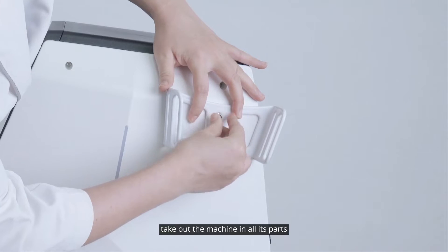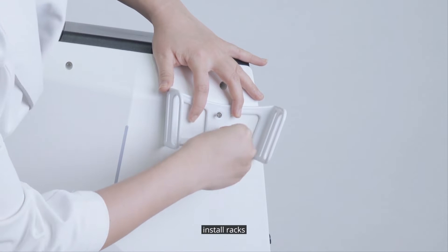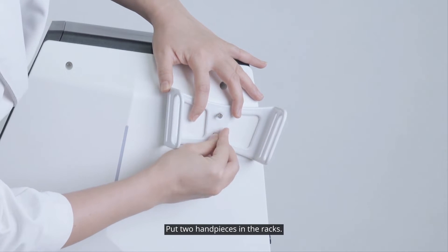Take out the machine and all its parts. Install racks and put two handpieces in the racks.